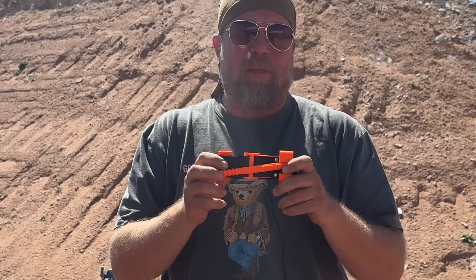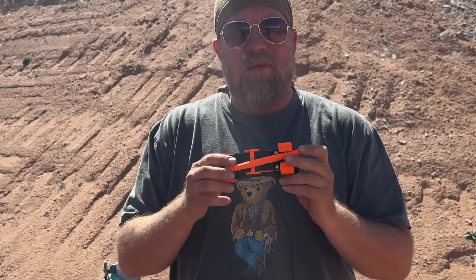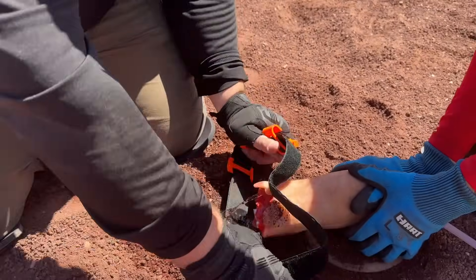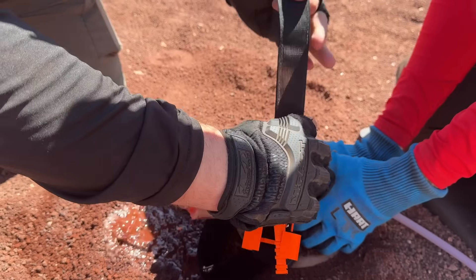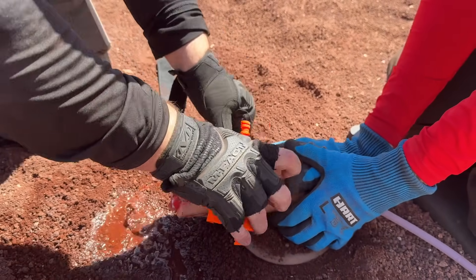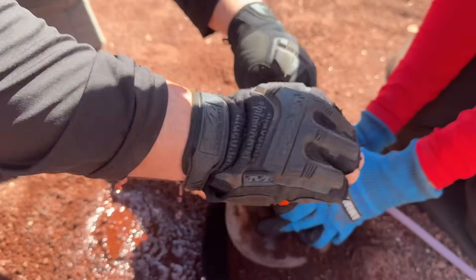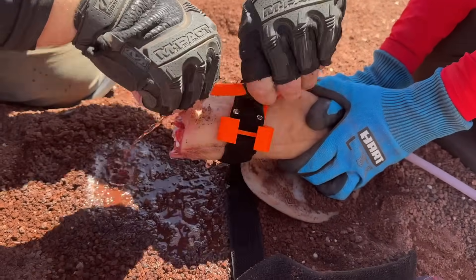We're going to show you how to properly apply a tourniquet on this dummy we have right here, which is actually part of the stage. Bob is leaking here. First, open the tourniquet and apply it as high up on the limb as possible, then tighten it not via the windlass but via the strap. Wrap it around until the Velcro applies.